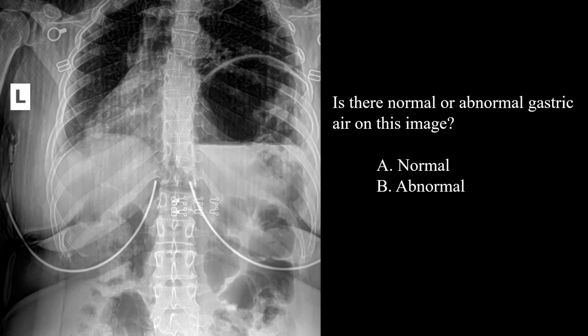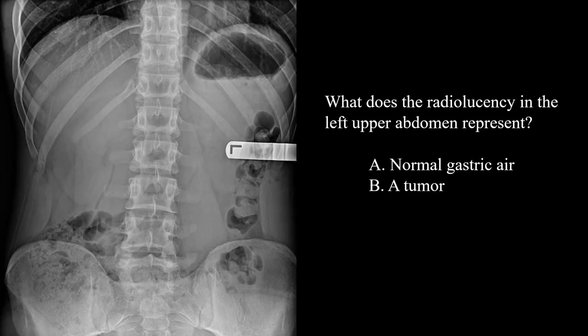Is there normal or abnormal gastric air on this image? This would be abnormal — the gastric air should be on the left side of the patient, but this air is on the right side, and this is not normal. And finally, what does the radiolucency in the left upper abdomen represent? And of course that would be normal gastric air.